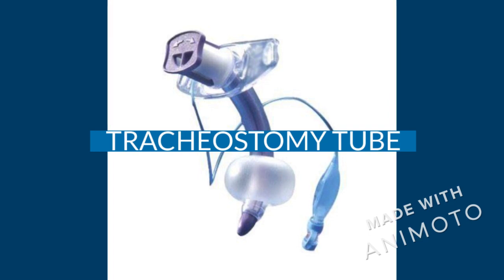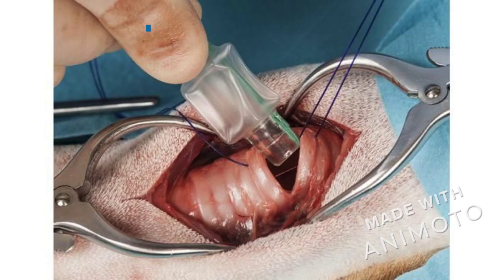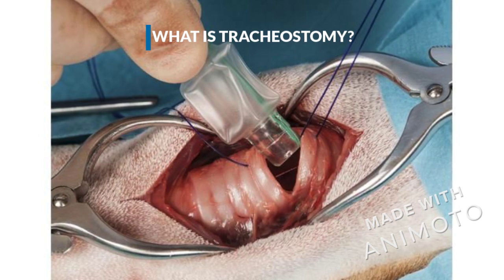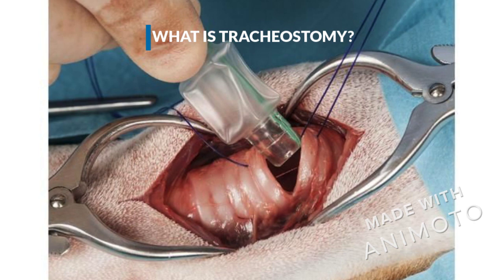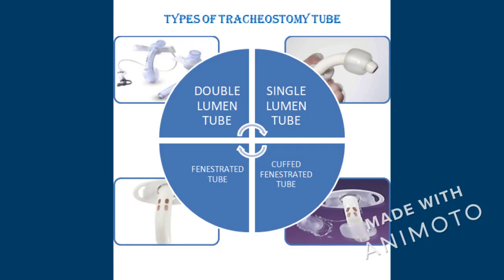The next topic that we are going to learn here is the tracheostomy tube. So we are going to learn what is a tracheostomy tube. A tracheostomy is an opening made surgically directly into the trachea to establish an airway. Tracheostomy tube is inserted into the trachea through this opening.